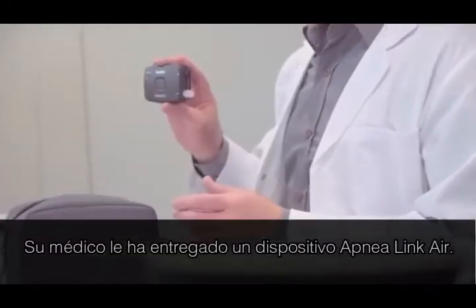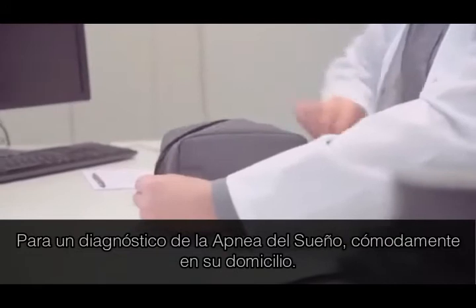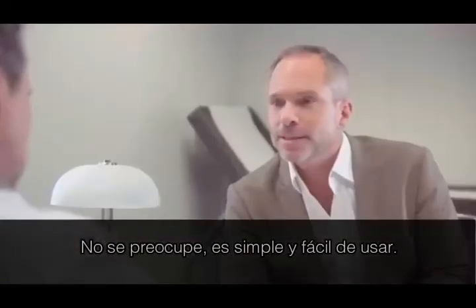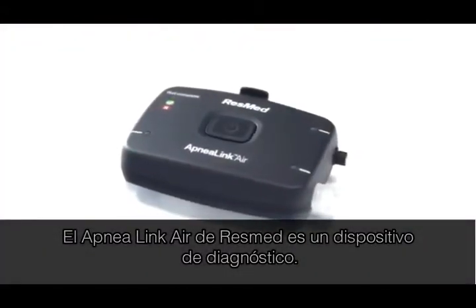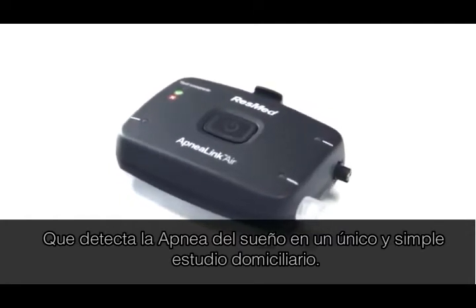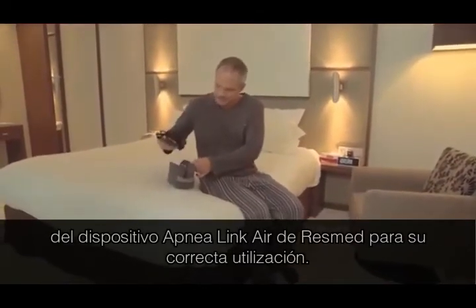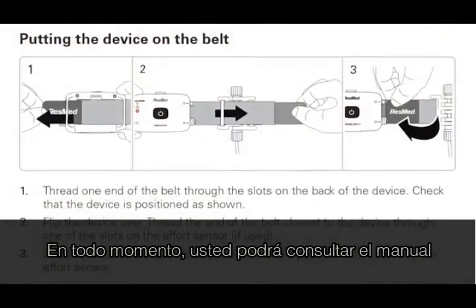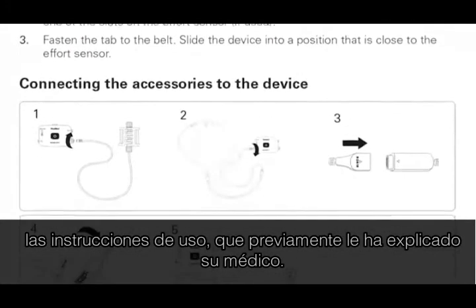Your clinician has recently given you an ApneaLink Air device to get tested for sleep apnea in the comfort of your own bedroom. Don't worry, it's simple and easy to use. ResMed ApneaLink Air is a device which helps to detect sleep apnea in one quick and simple overnight study. This short video will help to familiarize you with ResMed's ApneaLink Air and make sure you use it correctly and efficiently. At any time in the setup, you can also refer to the patient instructions provided by your clinician to get further details.